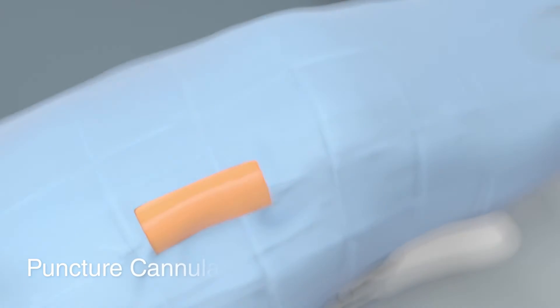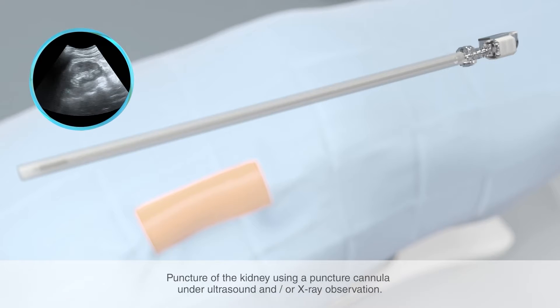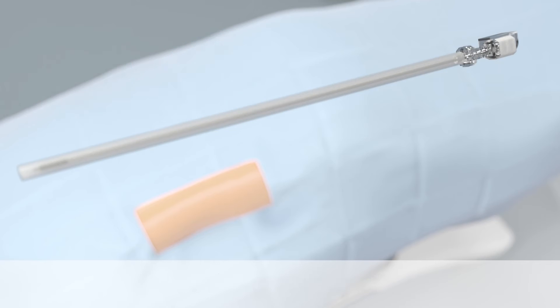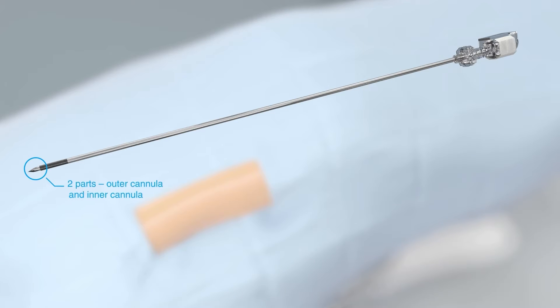At the beginning of the application, the kidney is punctured using the puncture cannula. To check the position of the puncture cannula, this procedure is performed under ultrasound and/or x-ray observation. Remove the protective tube from the puncture cannula. The puncture cannula consists of an outer and an inner cannula. It has a 17.5 gauge diameter and is suitable for guide wires up to 0.038 inches.